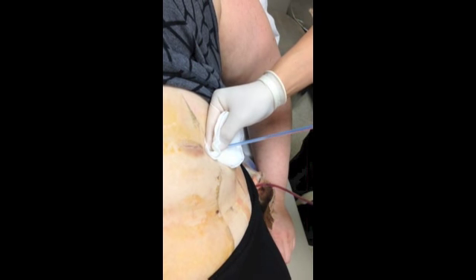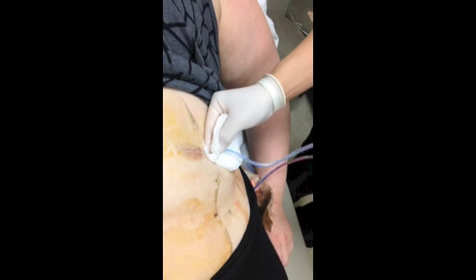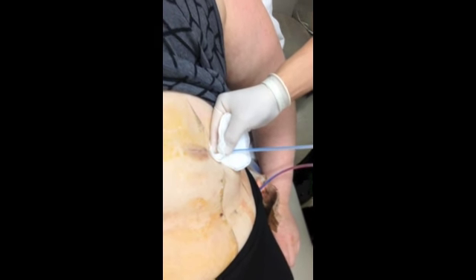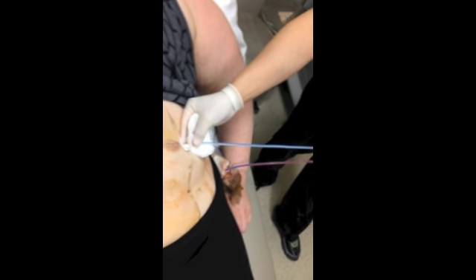Just like giving birth. She feels weird but it's not painful. Concentrate on the breathing, perfect, keep doing that deep breath — good — and it's out.